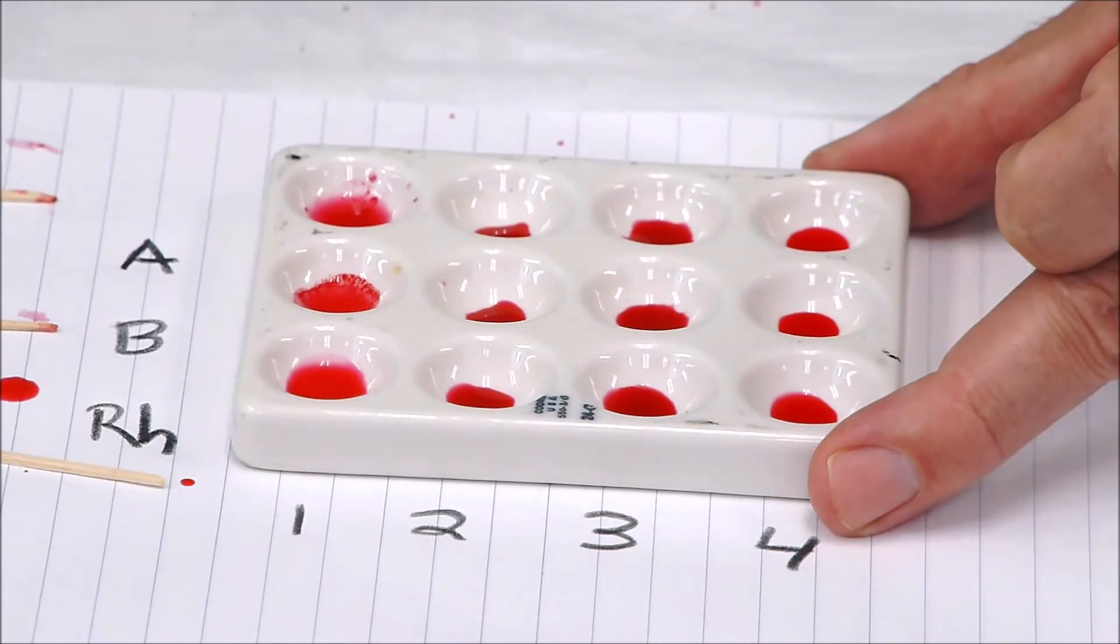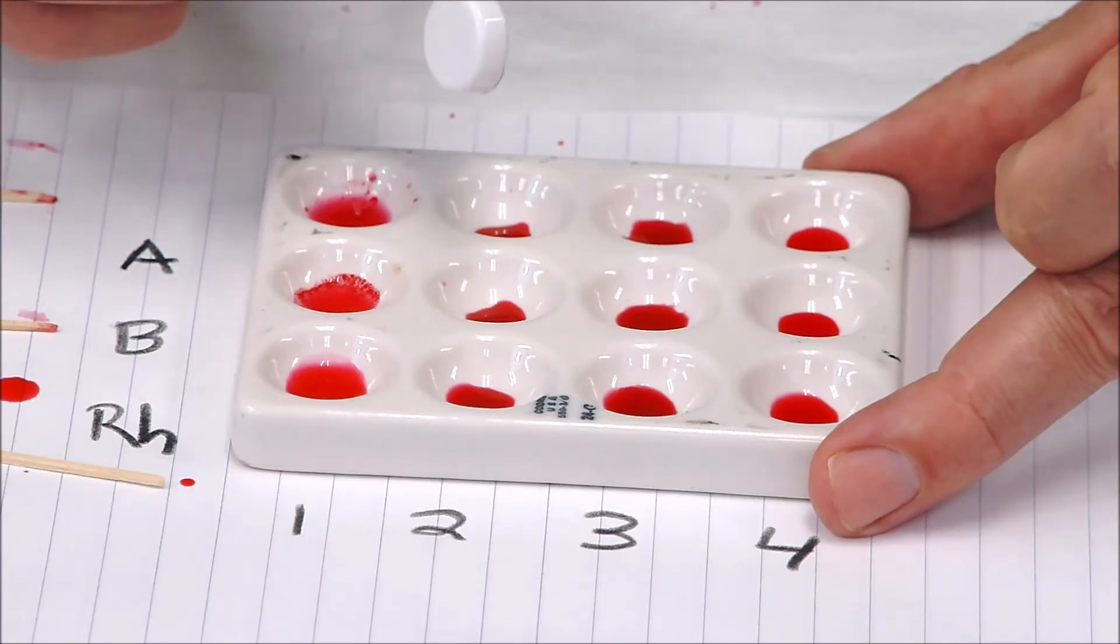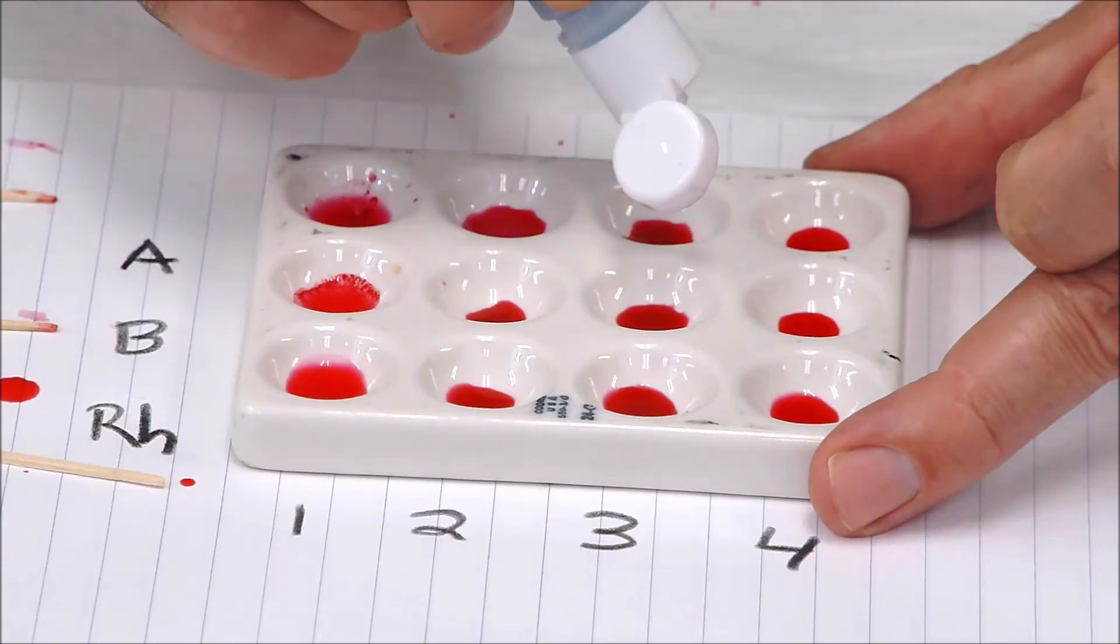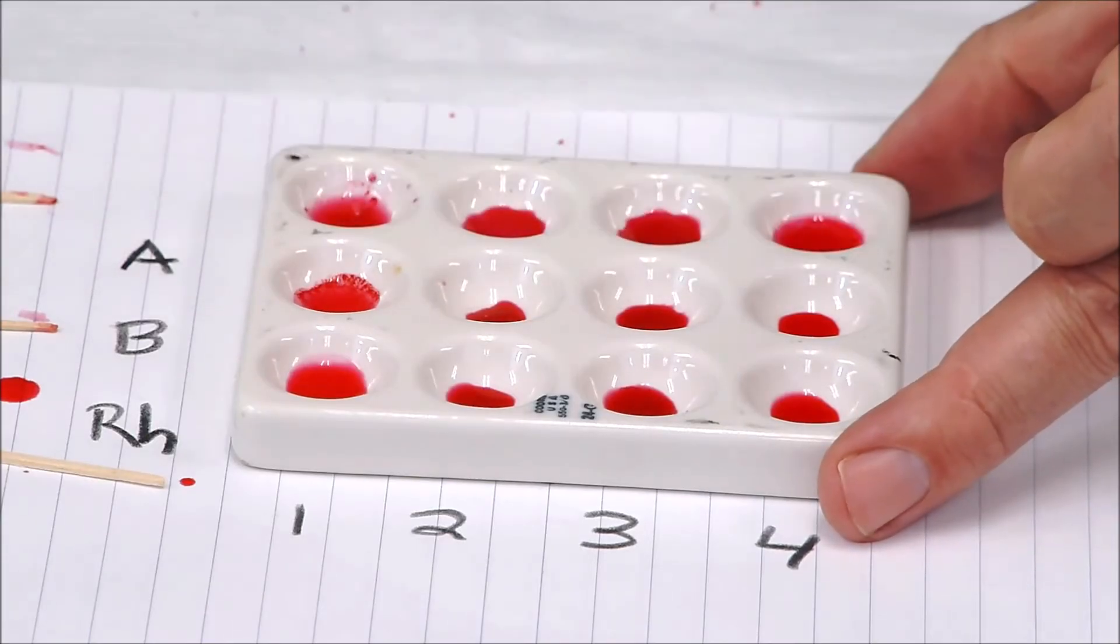Okay, again trying not to cross-contaminate anything. So samples two, three, and four—I can go ahead and add my A. So A antibody is going to go across this way: sample two A, sample three A, sample four A. I'm going to do the same thing for my anti-B: one, two, three.